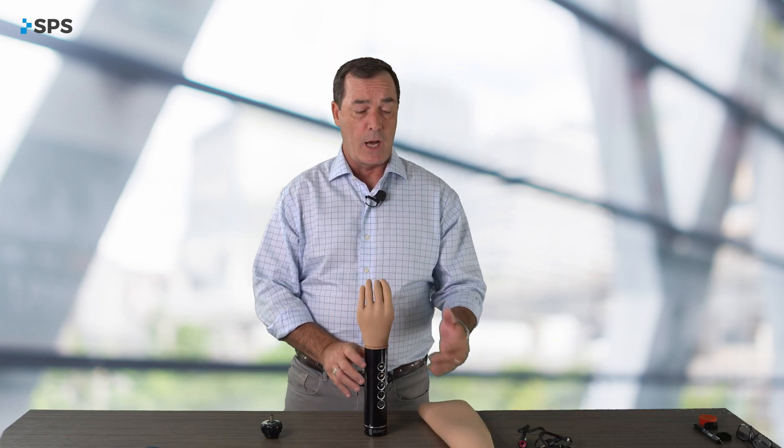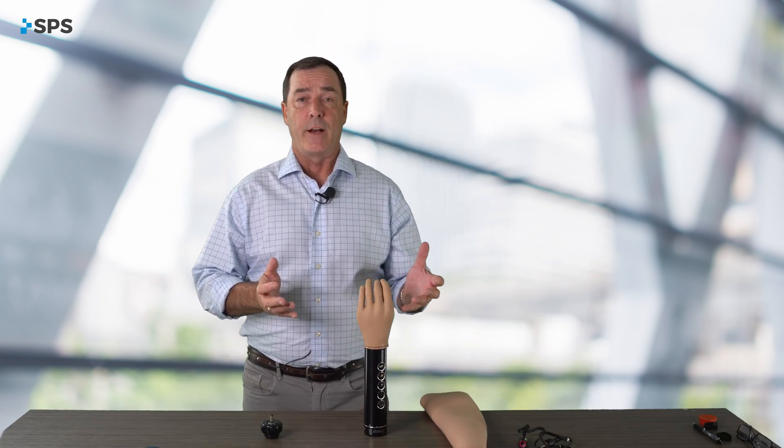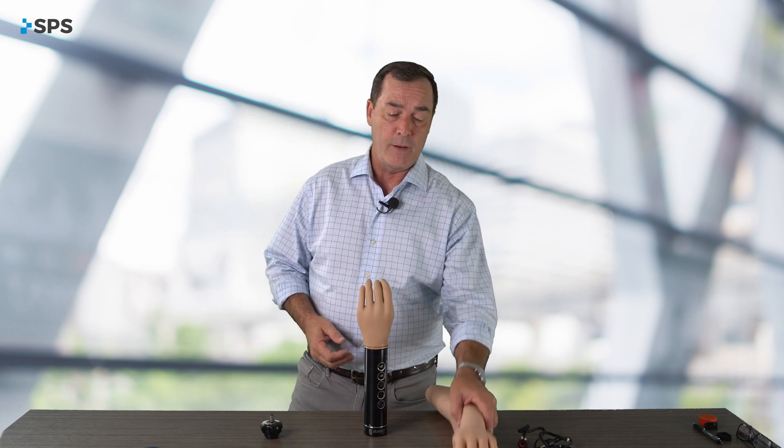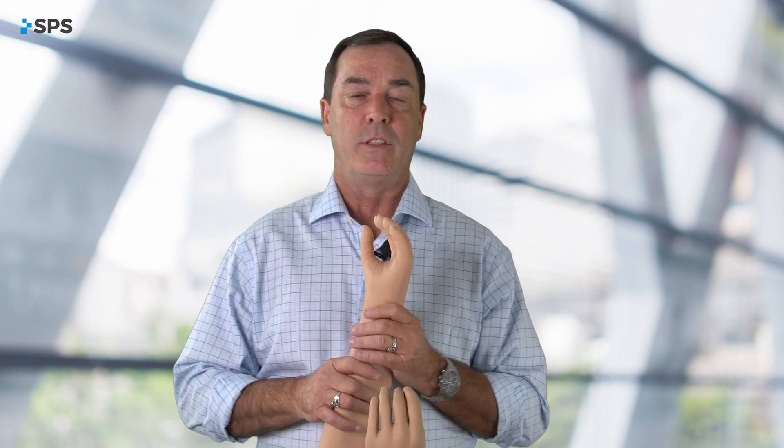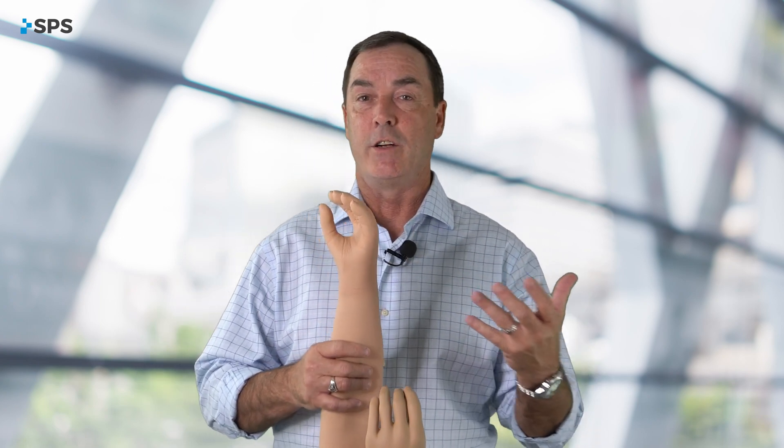The Kinesi hand also gives you the option of using a standard glove, like a PVC glove, or an elegance glove from Steeper. You'd utilize your same color swatches for your Skinnergy skin.